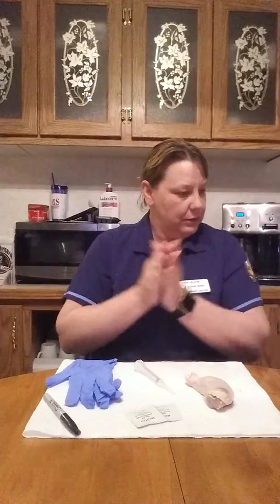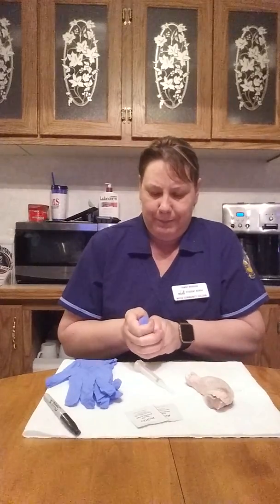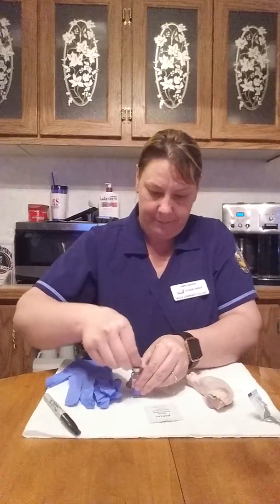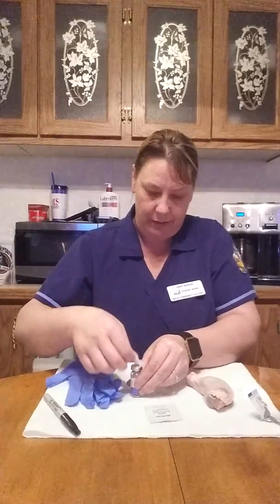So I'm going to go ahead and get the medication ready, and you just roll it between your hands, never shake it and make bubbles in there. And I'll pop the top off. I'm going to go ahead and clean the top of the vial with some alcohol, just a regular alcohol pad.